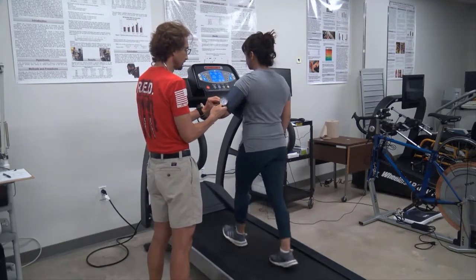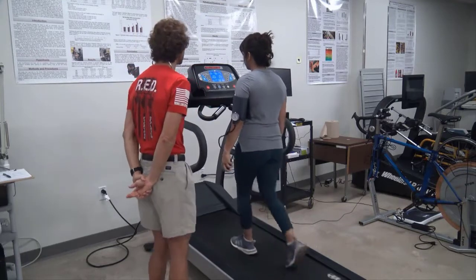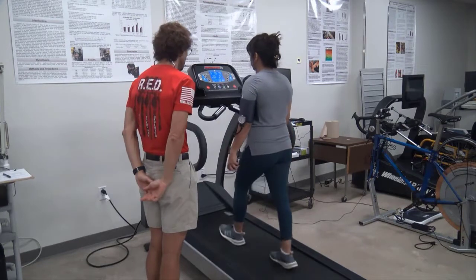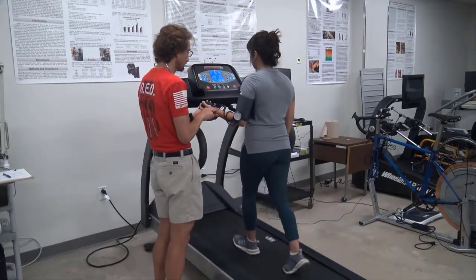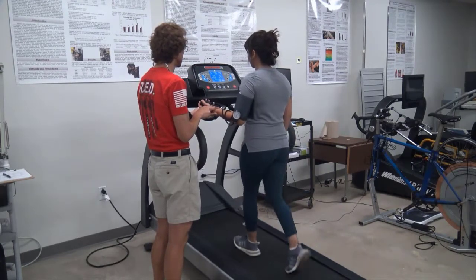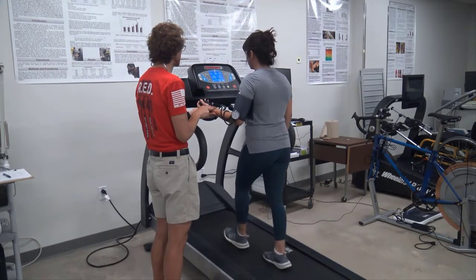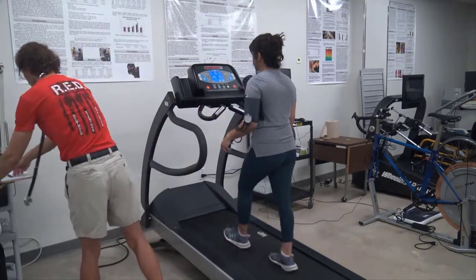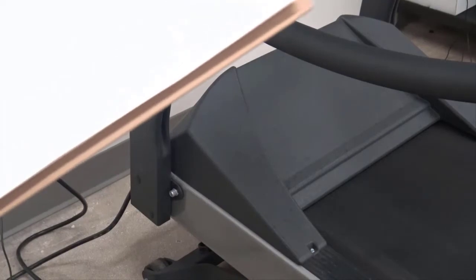Ten seconds before the end of the first minute is the point at which you should take heart rate. Take a 10-second pulse count and multiply that by 6, since there are six 10-second intervals in one minute — this will give you their heart rate. You can use the timer on the treadmill, your watch, or whatever timing device you need to keep track of the 10 seconds. Notice how the arm is being supported when taking the heart rate — it should not be holding onto the rails or resting on any part of the machinery. Record the heart rate and get ready to take it again during the second minute.